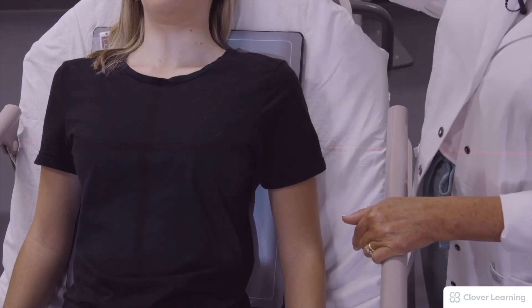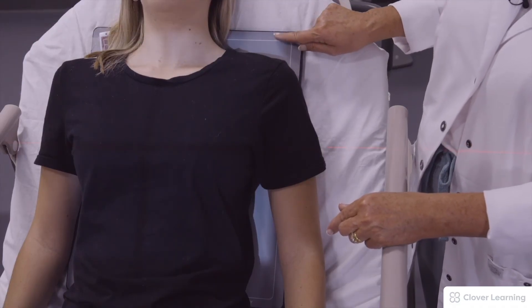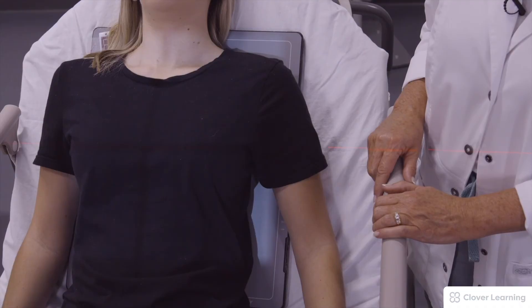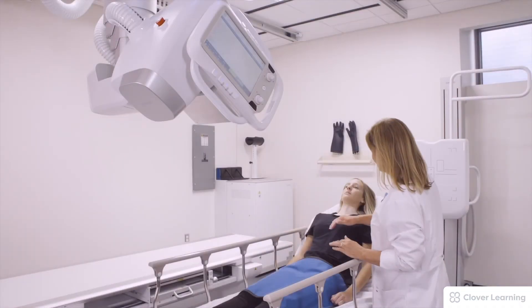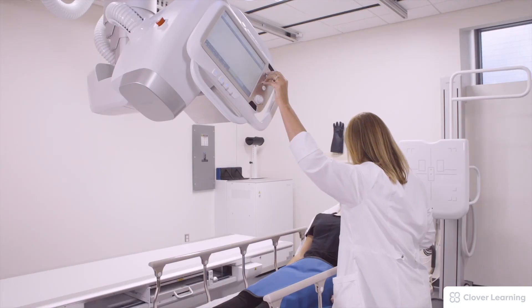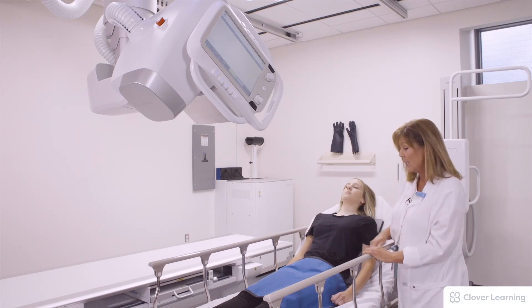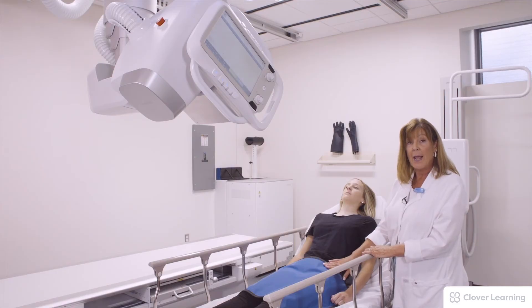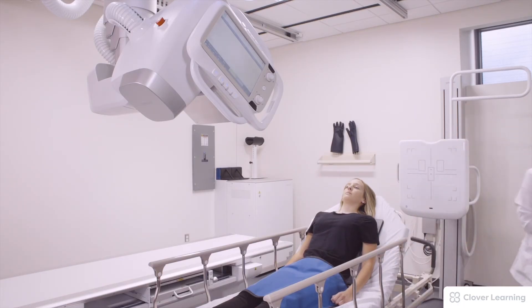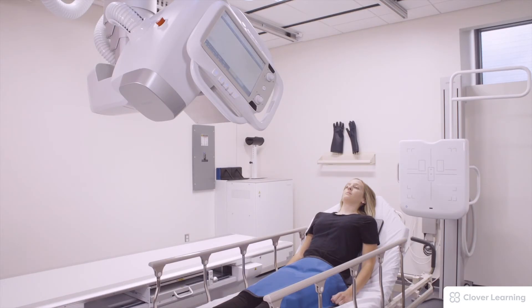My patient is small, so I have chosen to put the IR in lengthwise. We should see an inch and a half above the level of her shoulders in the light field, and a little bit of light on either side of her. Depending on body habitus, you might need to turn your IR crosswise. We're centered to the mid sagittal plane. Our collimation should be 14 by 17. We're going to use a right marker on the right side of the patient. We have shielding on our patient, and the breathing instructions are on the second inspiration. The patient takes in a big deep breath, blows it all the way out, takes in another deep breath, holds, and the exposure is made.